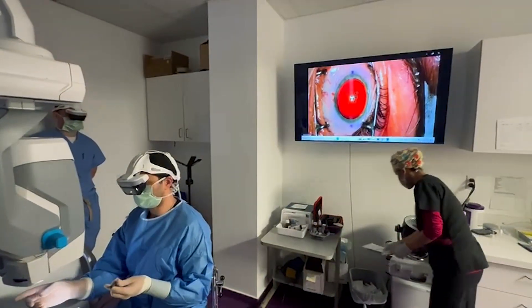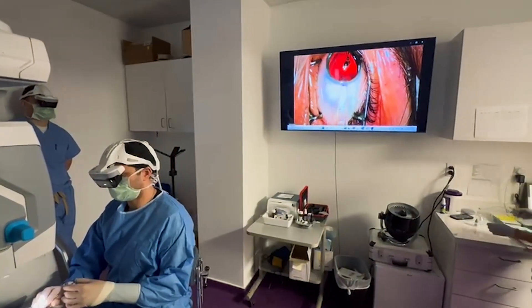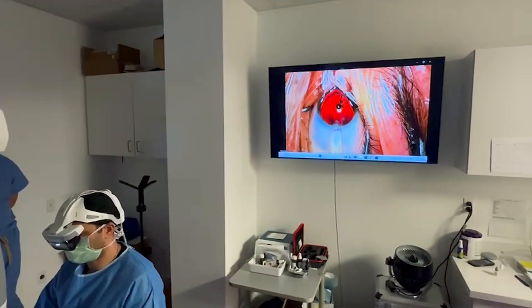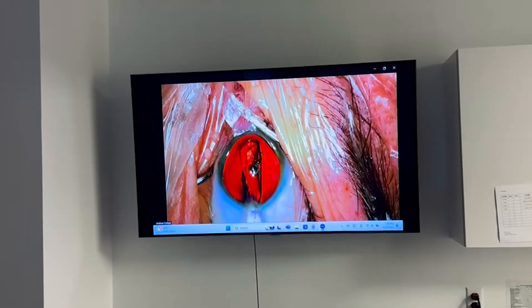Now I'm taking the inserter and orienting it right in that wound, and I am very gently, slowly inserting this lens into its position. I want to make sure that it's not flipping on me, it's not rotating, and I'm using those little holes as guides. It does take some getting used to, but there it is opening up just fine, just the way I'd like it to.